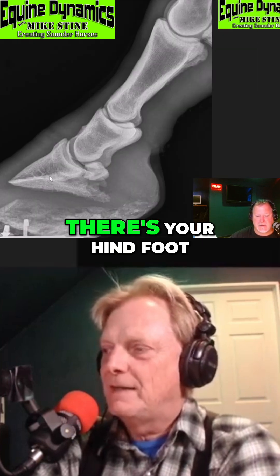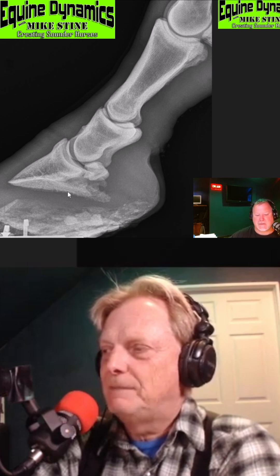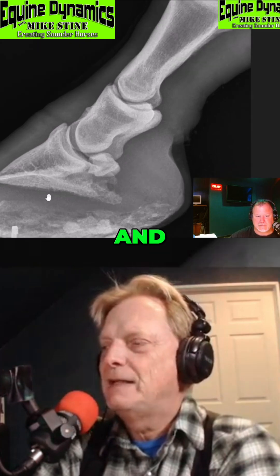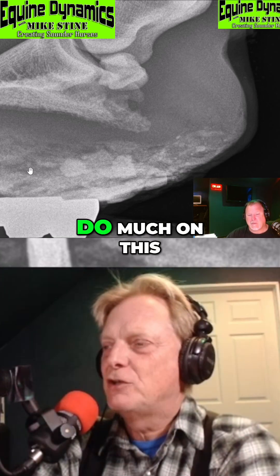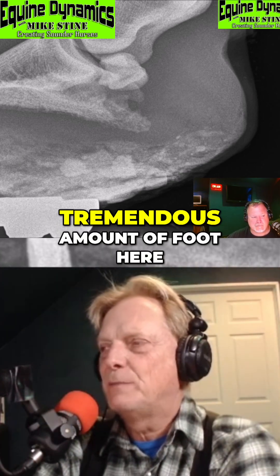Switching over to this one here — there's your hind foot. That's the worst foot on the horse. The other hind foot — the pastern kind of looks like a DSLD horse dropping. The question is, did they decide not to do much on this foot and get a foot on because the horse didn't want to stand on the other? Because there's just a tremendous amount of foot here.